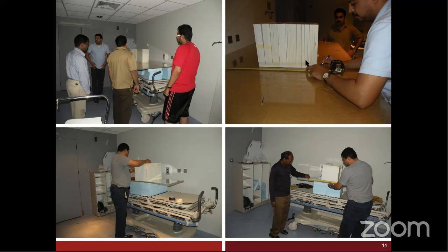So everything is going to be higher than that. So if, for example, they lower their prescription to 180, then we will guarantee that the dose in the patient is going to be between 220 and let's say 180, which is within plus or minus 10% of the 2 grays that they wanted. But they did not want that. And they said, we're fine, we just want the 2 grays. So that might be the reason.